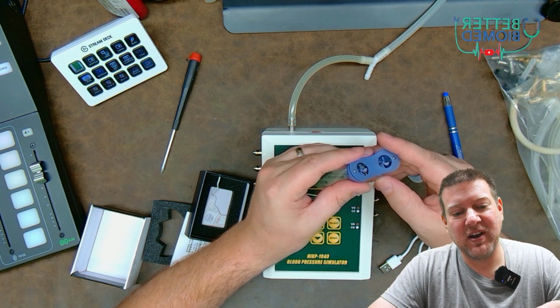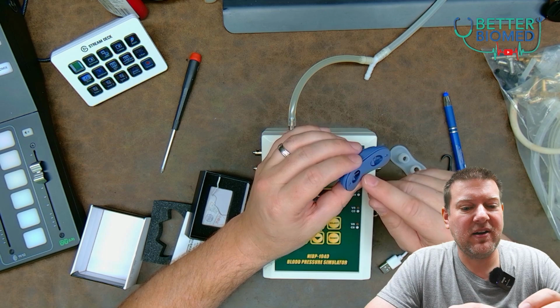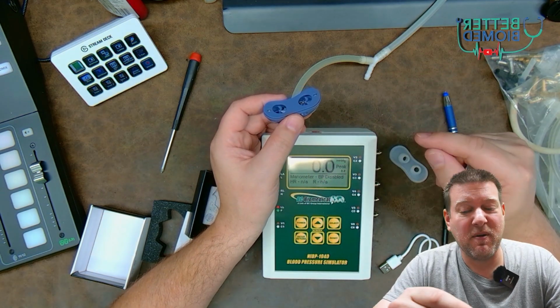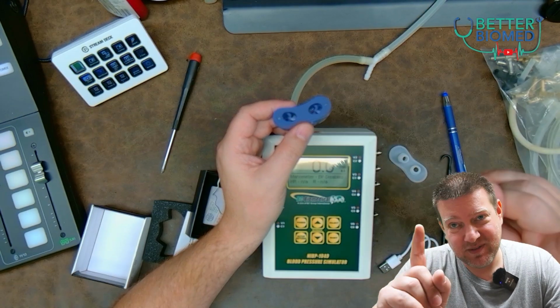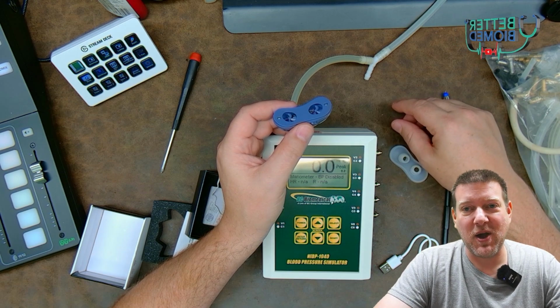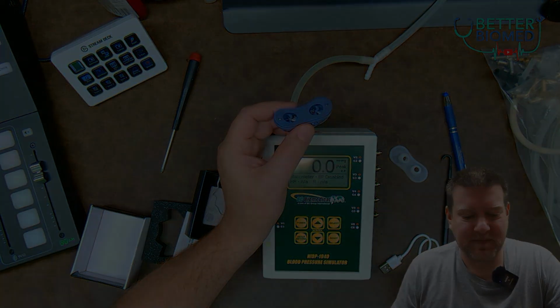But I'll tell you what we're going to do. We're going to go ahead and let it charge for a few hours, and the tiny battery, whatever's inside here, we're going to give it a fighting chance. We'll see if it can generate even 0.1 of a millimeter of mercury. That's all I want, just 0.1. And this guy is sensitive enough to do it. So, let's do that next. We'll come back in just a few moments.